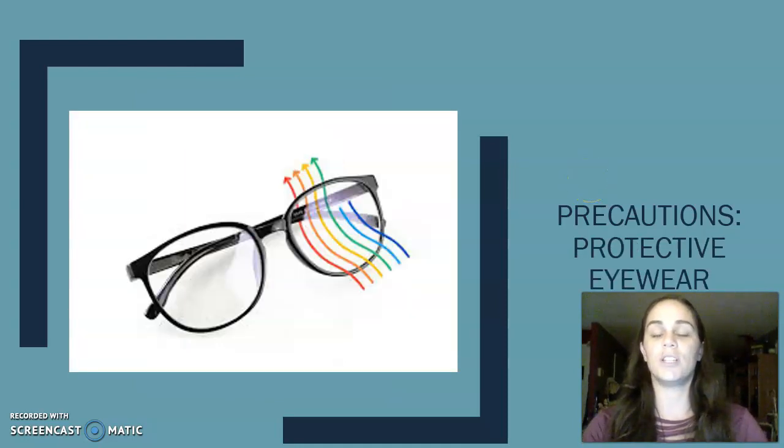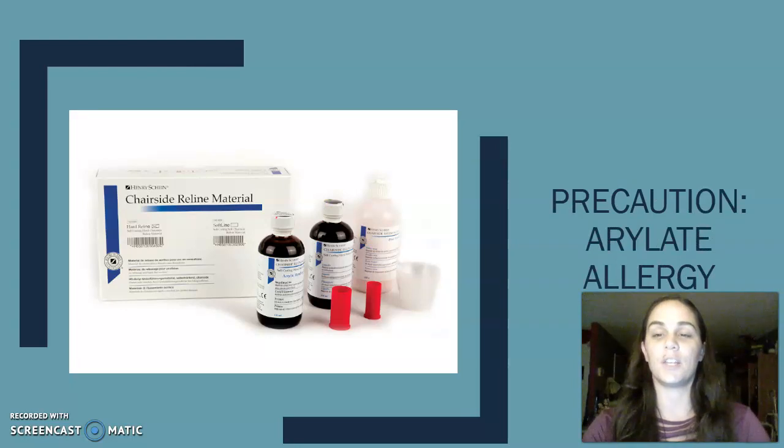Another precaution when using the light spectrum sealant is to use protective eyewear because the blue spectrum can be harmful to your eyes. Another precaution is an acrylate allergy. The general rule of thumb is to just not use it if you know that you have that allergy.